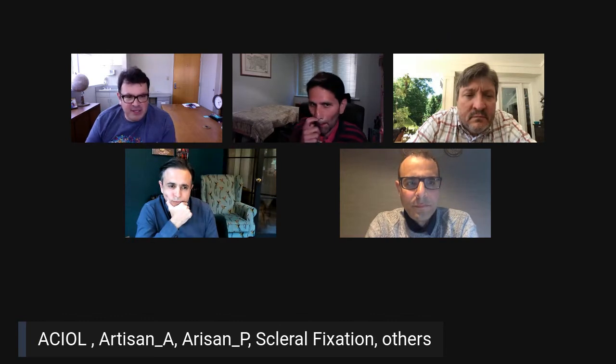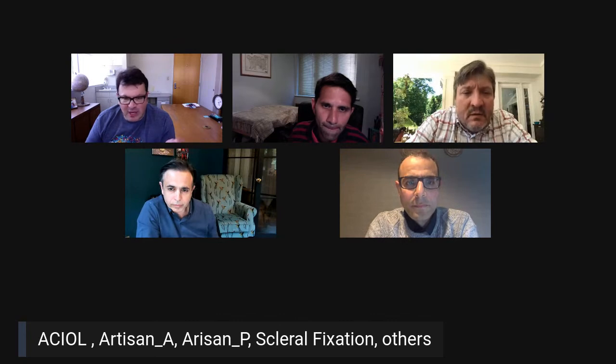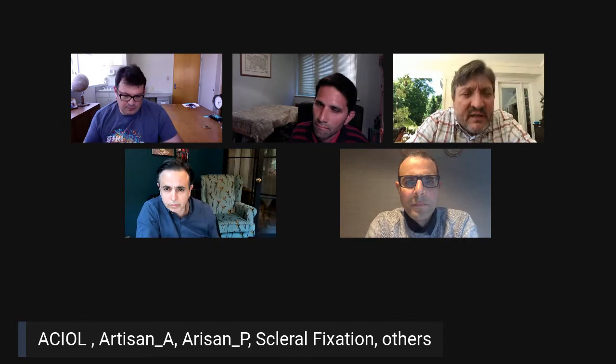Okay, so quick word from everyone. So Felipe, you do Artisan and scleral fixation, correct? And you will show us more on that. Yeah. And Chris, you do scleral fixation. There's no Artisan, unfortunately, in the US. I like the 7mm optic, the CZ70 rigid PMMA lens. One comment I wanted to make that I really enjoyed in all of the ACIOL videos is that everybody made ample wounds.